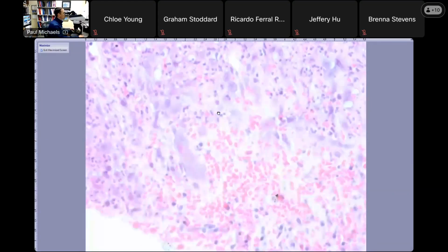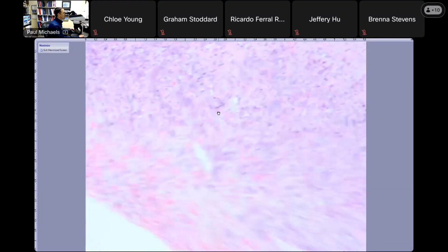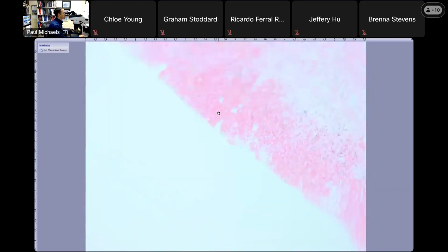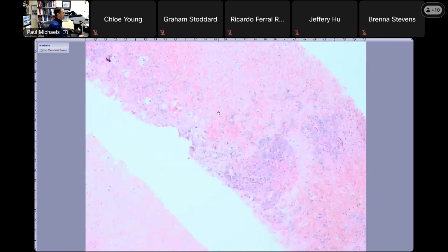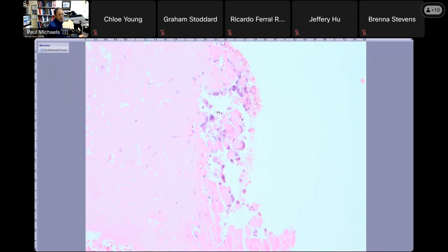And I was told that if you have a tumor that's kind of epithelioid with a lot of neutrophils, here's some necrosis, to think about vascular tumors. So an angiosarcoma is rare in viscera, but adrenal gland is one of the more common sites for it to be. And I've showed you this before in that inguinal core biopsy I had when I was in person a few months ago. This is a really common pattern of angiosarcoma.